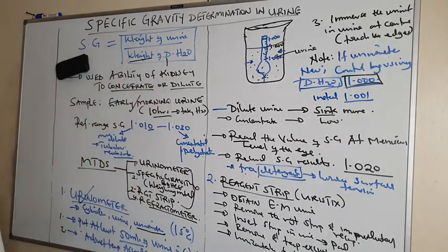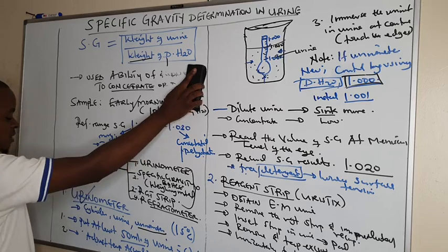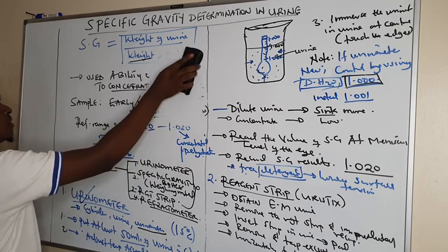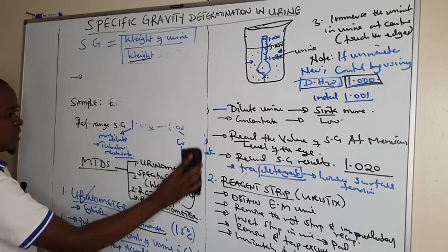The last method we are going to talk about is the specific gravity bottle. This is mostly asked in exams, so you have to master it.